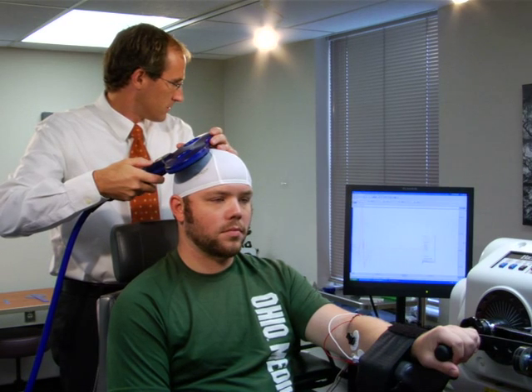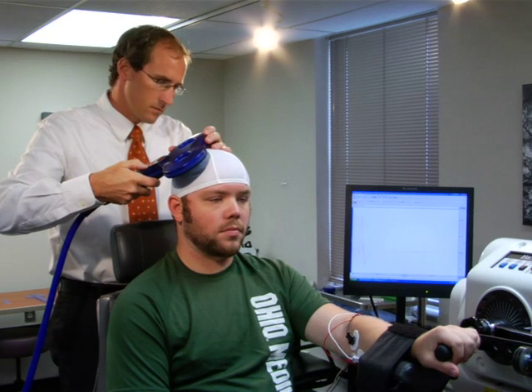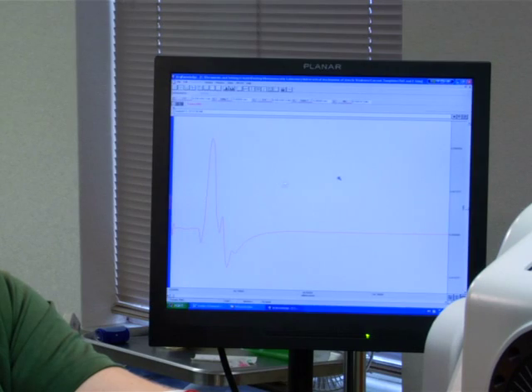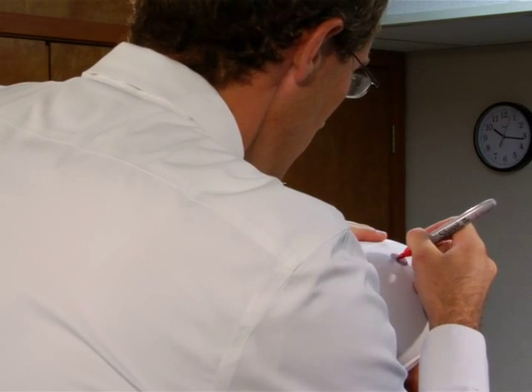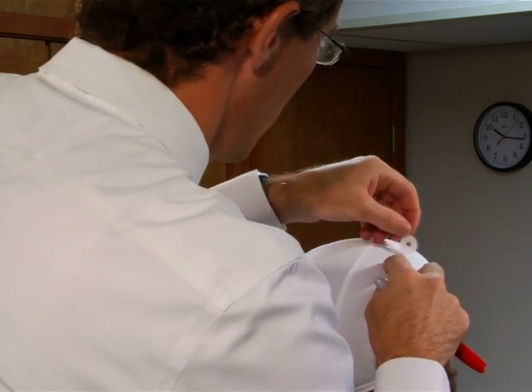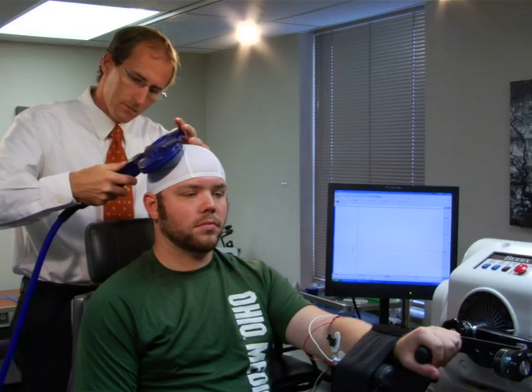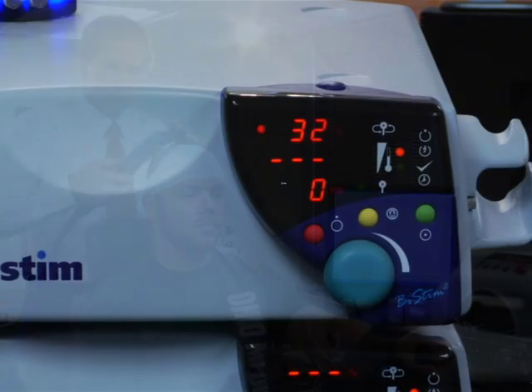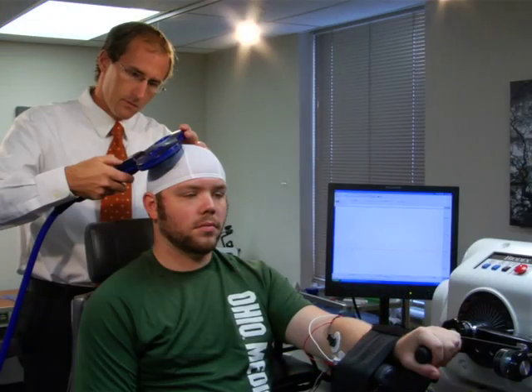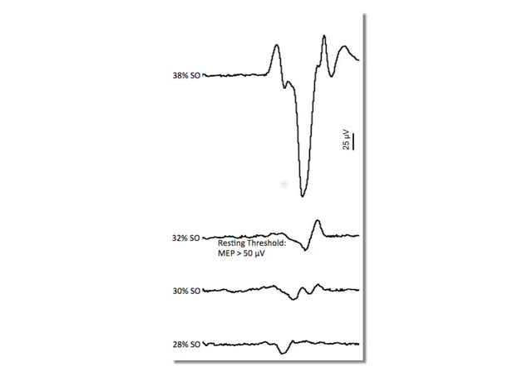Next, subtly move the TMS coil around in very small increments to determine the stimulation location that elicits the largest motor evoked potential for the FCR muscle. Once located, mark this area with indelible ink on either the scalp or a Lycra cap. Now quantify the motor threshold for the FCR by delivering single pulses at gradually increasing stimulation intensities until motor evoked potentials have peak-to-peak amplitudes greater than 50 microvolts in more than 50% of the trials.